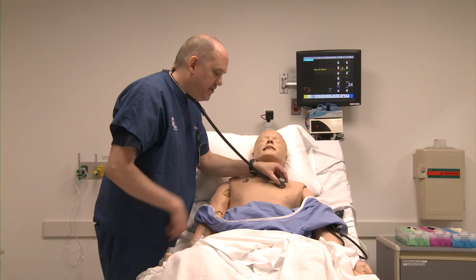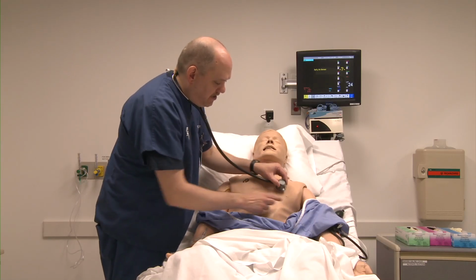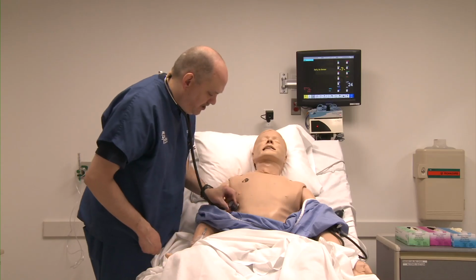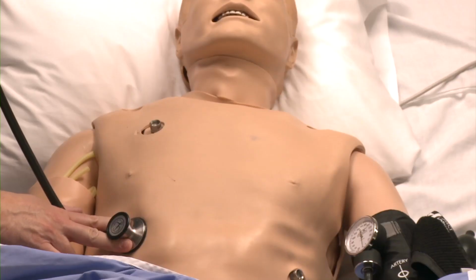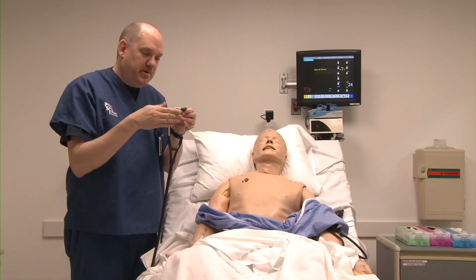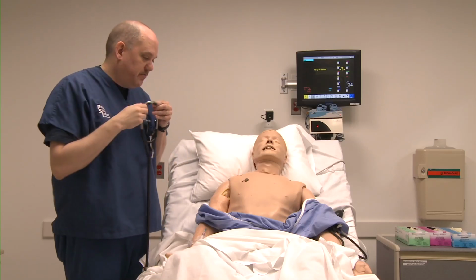To listen to the bases of the lungs, we want to have our stethoscope about an inch below the nipple line and more or less in line with the nipple on each side of the chest. Now, it's important to note that you have to put your stethoscope in your ears properly. Make sure that the earpieces are angled into your ear canal and not out toward the fleshy part of your ear.